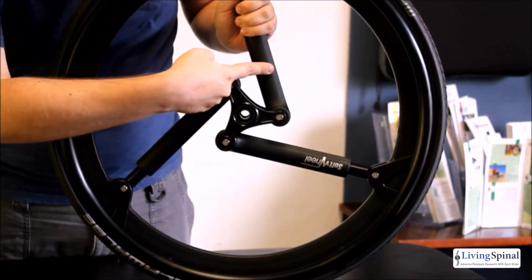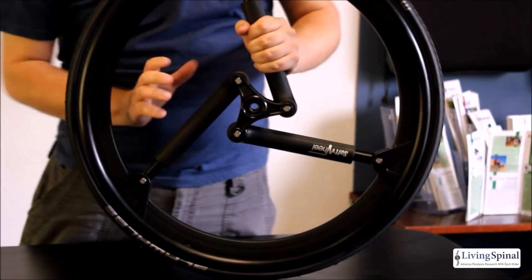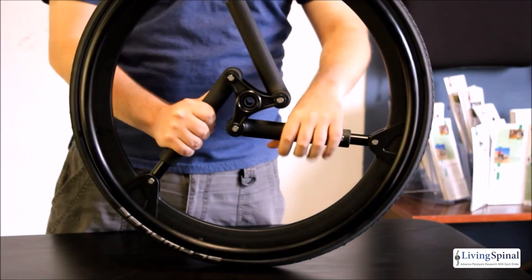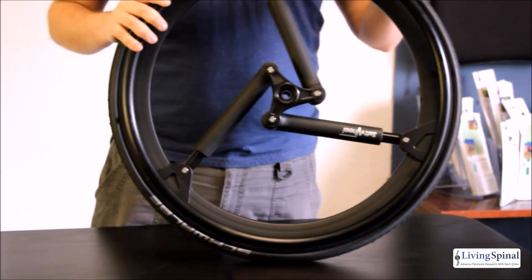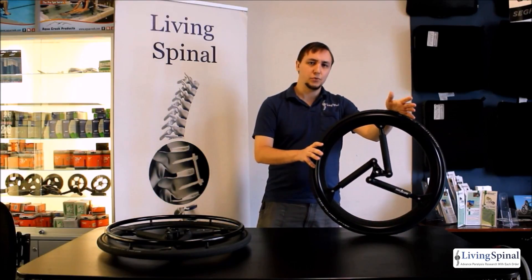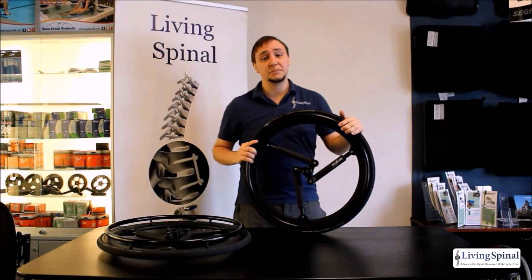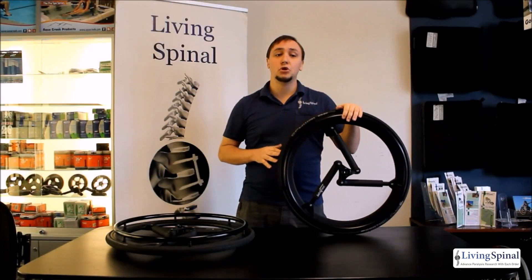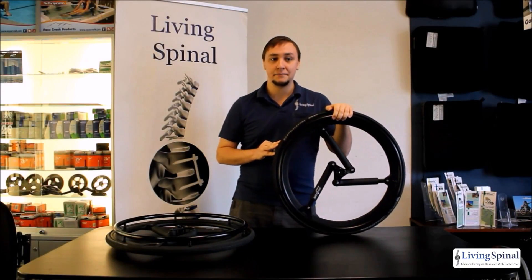The Soft Wheel uses three compression cylinders to absorb shocks within the wheel before they are transferred to the chair and the rider. This makes forest trails and dirt roads feel a lot like you're riding on pavement. On flat terrain it rolls a lot like a rigid wheel, but on impact the suspension mechanism absorbs the shock. Overall this gives you a much smoother ride in your day to day.